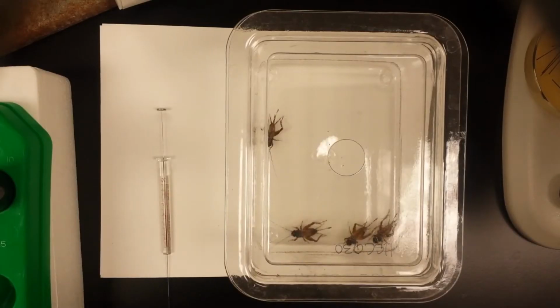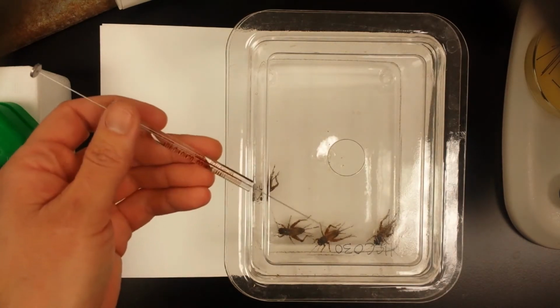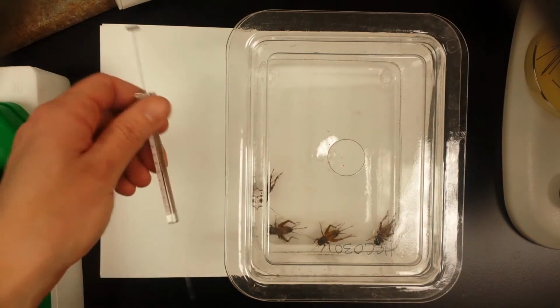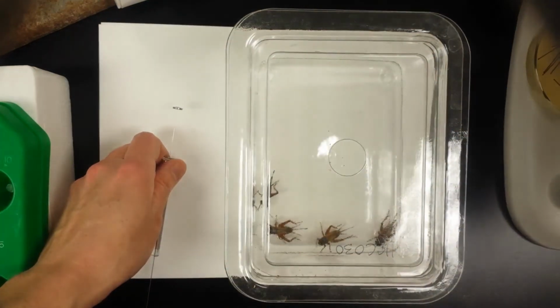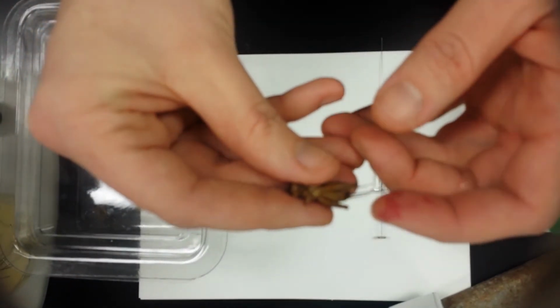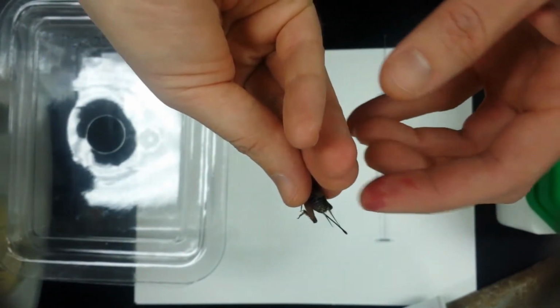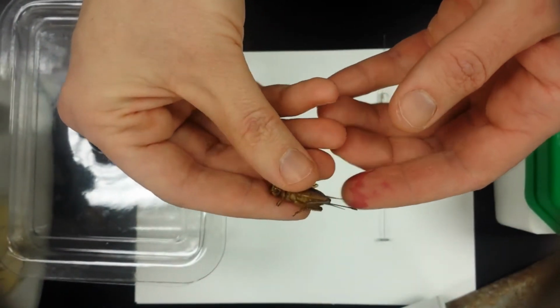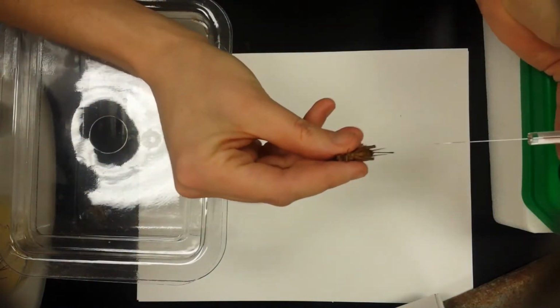These are the crickets that we would have been working with if we'd been able to stay here at Siena. And what I'm going to do is show you how I can inject a cricket with 5 microliters of this red amaranth dye solution. Okay, so what I've got here is a short-winged female. So she's got an ovipositor here to lay eggs, but you don't see her rear flight wings sticking out at all. So I'm going to go ahead and give her this 5 microliter injection.